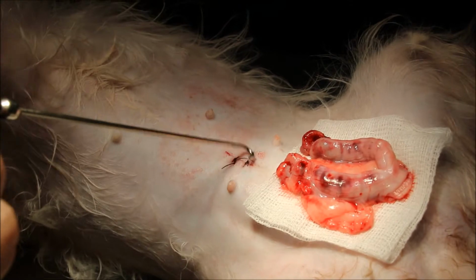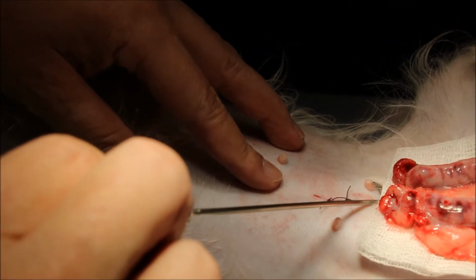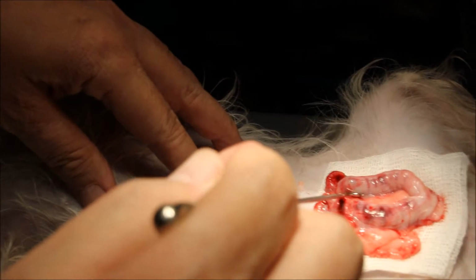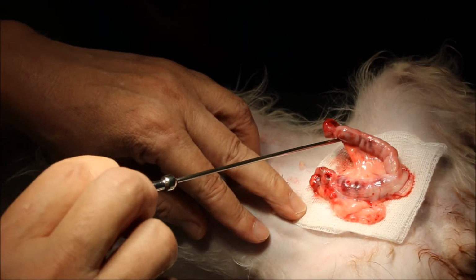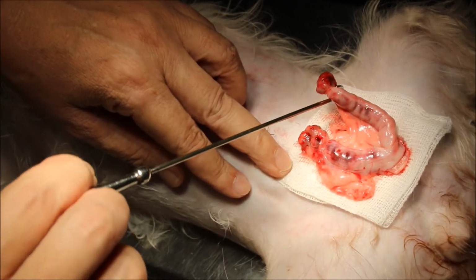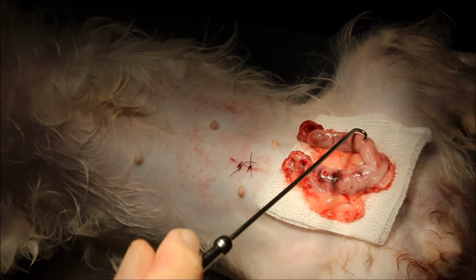So normally I do 45 degrees. Go in 45 degrees, turn the hook and pull out. So I demonstrate here. I go in, then I turn the hook and hook up. You see, hook up the left uterine horn first. Once you manage to hook this one out, the other one is easy already, because the other one just follows this one.